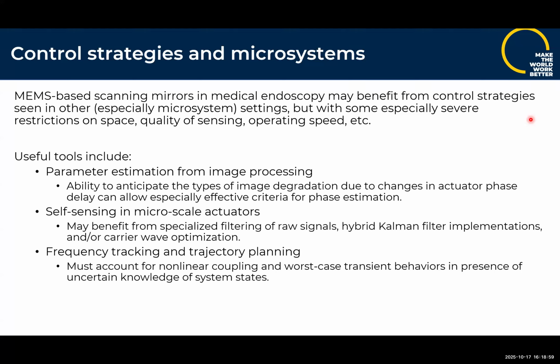Things like use of specialized filtering to do threshold detection and the phase delay detection. Certain image processing metrics work particularly well when you know what sort of scan patterns you're dealing with. So those are basically what I was going to talk about in terms of control applications in this area.